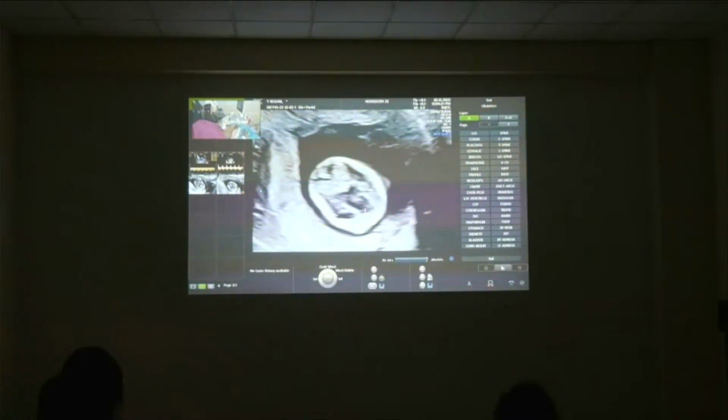So we see that the posterior border of the peduncles is a bit away from the occipital bone, which is normal. And if you draw lines across from the thalamus along the peduncles, we see that they converge towards each other. If they were parallel, then we would have to suspect open spina bifida, and even in case of open spina bifida, the cerebral peduncles almost reach up to the occipital bone.